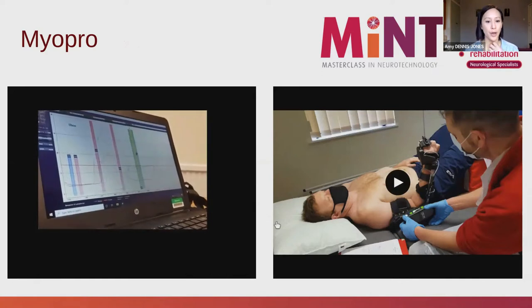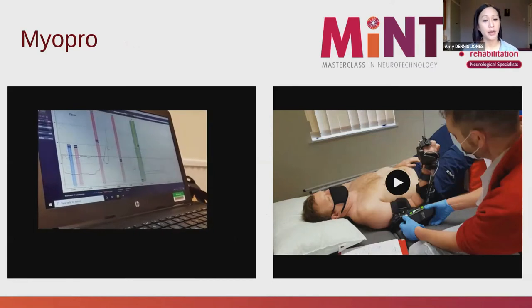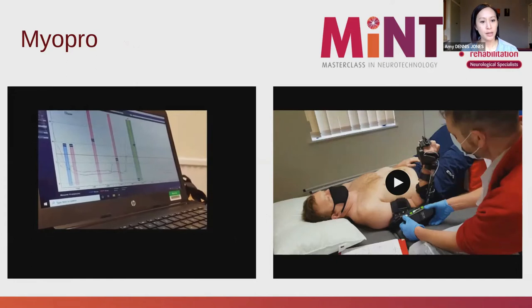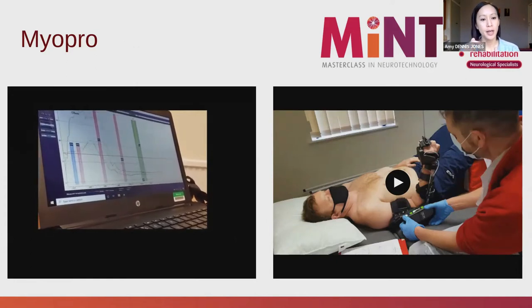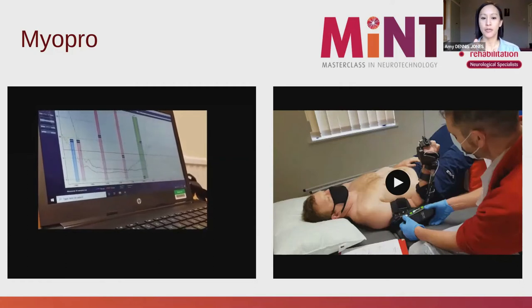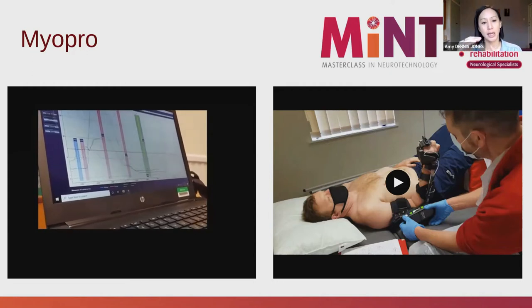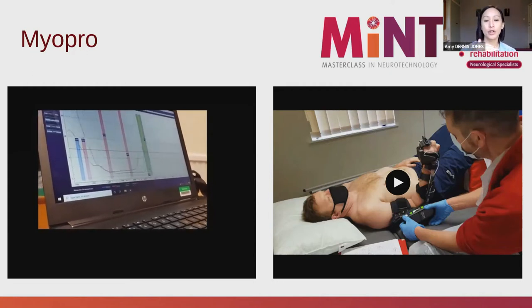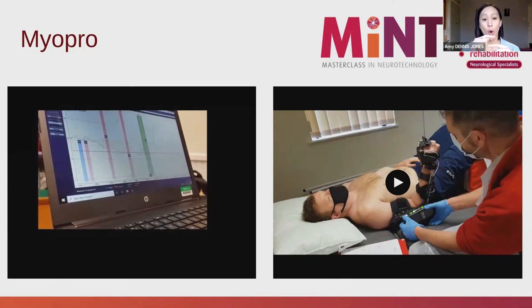So the first video you can see here is the EMG activation. Visually, the patient can have a look at the screen. What we're trying to do here, you can see there are two lines, one higher than the other, is we're looking at specific movements into flexion and extension of his elbow. And what you want to see is two distinct lines, one higher as you're increasing the EMG activity in one muscle group, and then reducing the antagonist EMG activity.